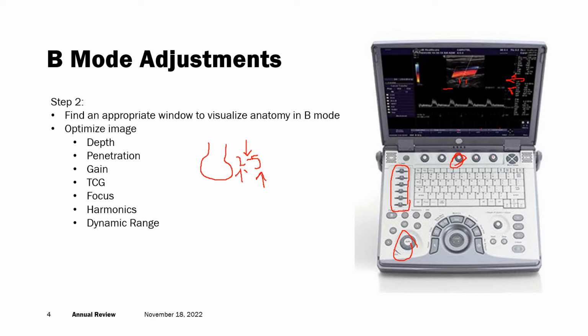So within the fluid-filled gallbladder, within a cyst, within the urinary bladder, within a vessel, things like that. And you'll see a lot of echoes and they're distracting from the image. Sometimes if you adjust your dynamic range, that can get rid of some of those echoes and allow you to see what you're intending to see. This can also work with needle tips and catheter tips as well. Get rid of some of those grays and limit it to a shorter scale of contrast so you see more blacks and whites that allow you to differentiate things more easily.